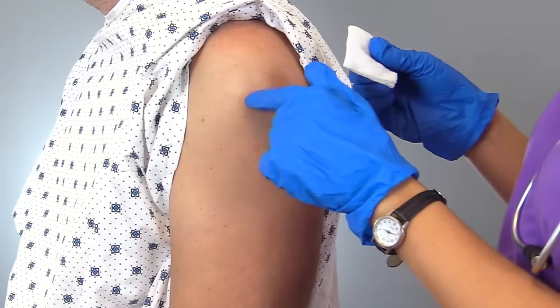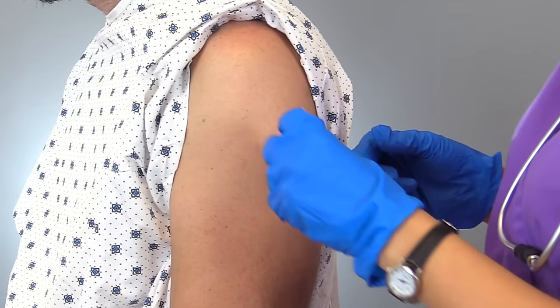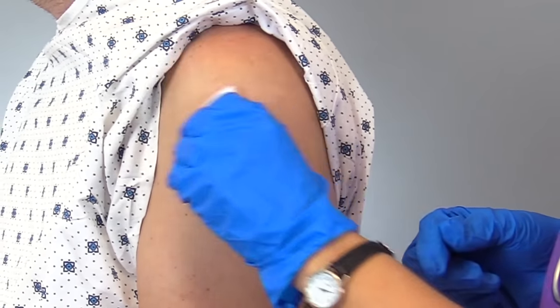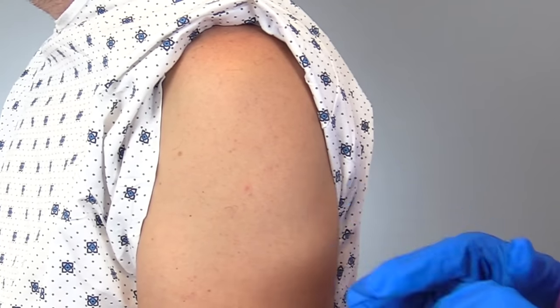Once we have our area, we want to clean the injection site. Take your alcohol prep, start in the center, and work your way outward to cleanse the area. Let that dry completely — don't blow on it, let it air dry.